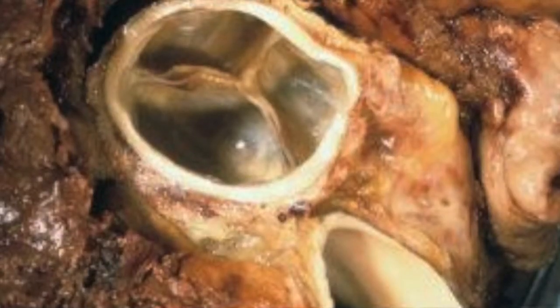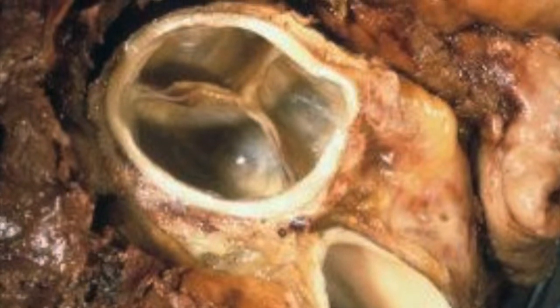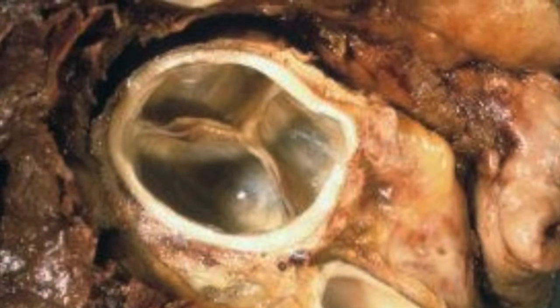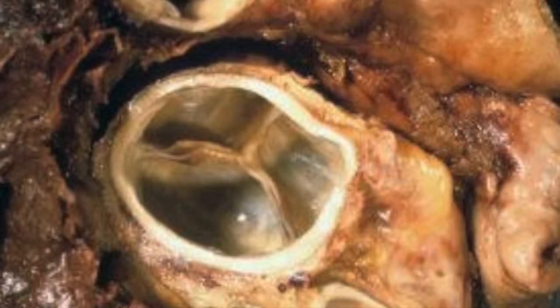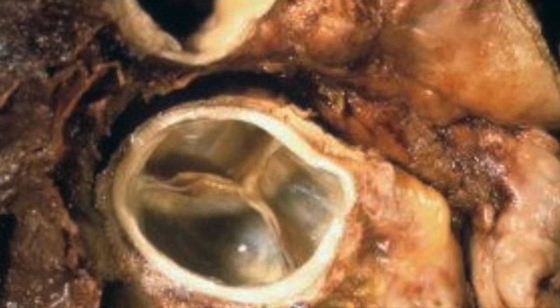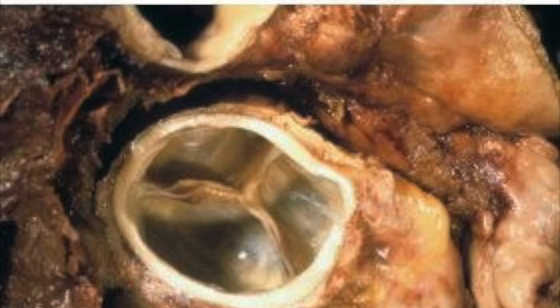Heart valves play an integral role in the regulation of blood flow during the cardiac cycle. Throughout one's lifespan, his or her heart valves will open and close over 3 billion times, and up to 20 liters of blood will course through them every minute when stressed. Heart valve leaflets are made up of a tough connective tissue and can be either tricuspid, consisting of 3 leaflets like the aortic valve pictured, or bicuspid, consisting of only 2.